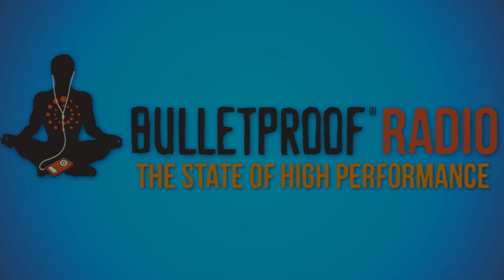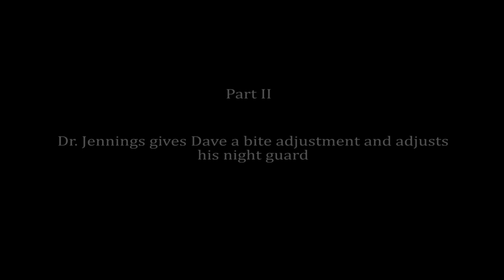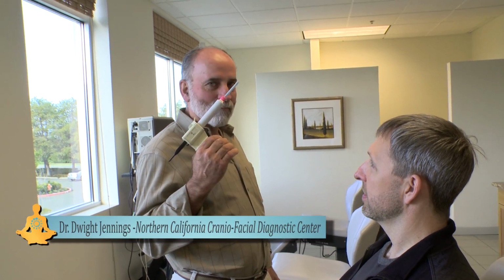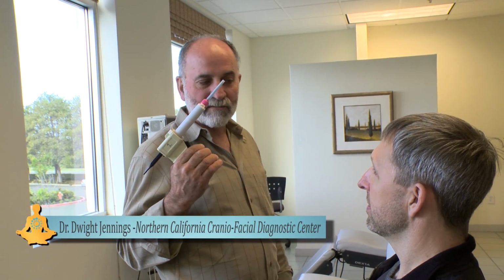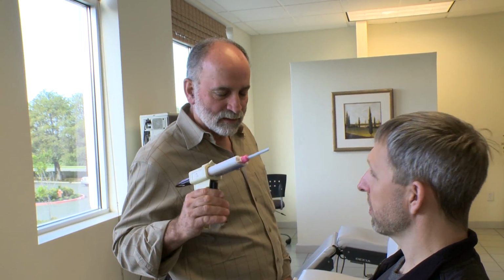Bulletproof Radio. This is polyvinyl siloxane. It's a silicone epoxy that sets up in about 15 seconds. And this is much higher accuracy at figuring out how teeth come together than either carbon paper or wax or anything else.